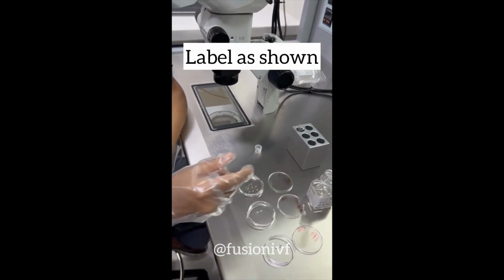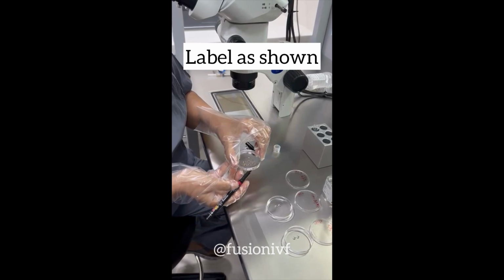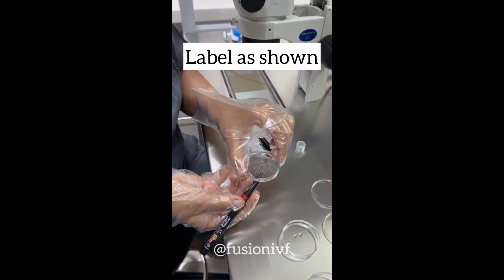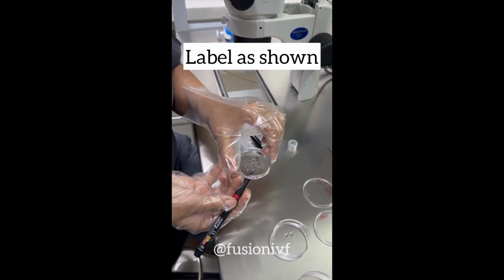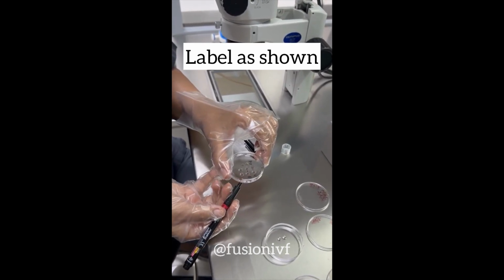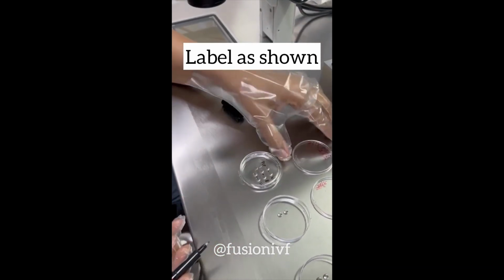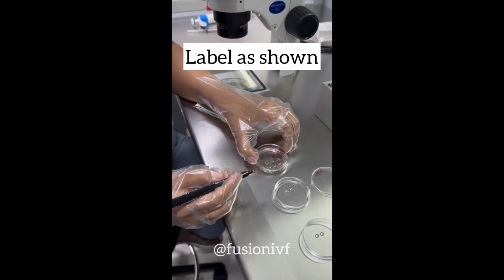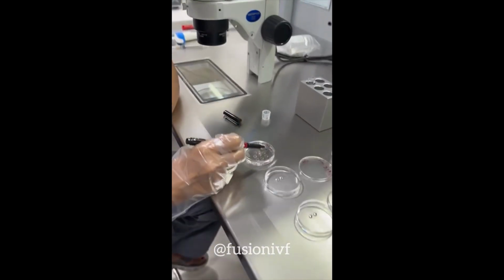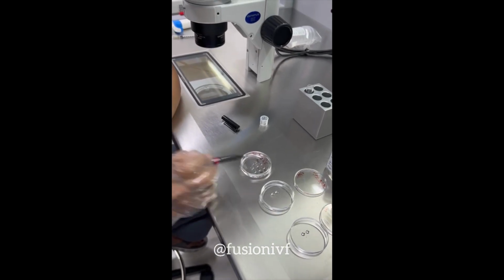So done. So these are the biopsy drops. These are the PVP drops. These two are the biopsy drops. And these upper two are the wash drops. These lower two are also the wash drops. So this makes a biopsy plate for 2 embryos. So this is the patient's initial, which we will write on the dish for the embryo which we are vitrifying. So mark 1 and 2, the first and second embryo for one patient.